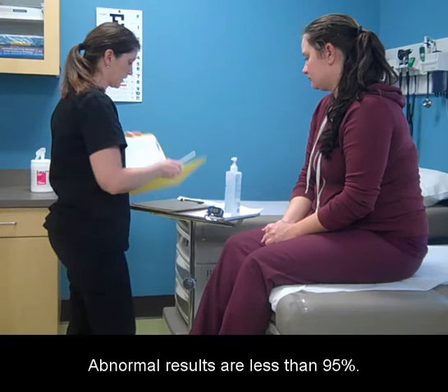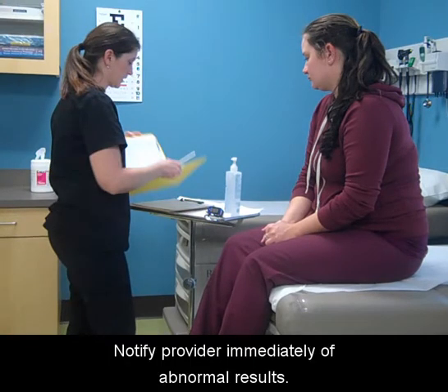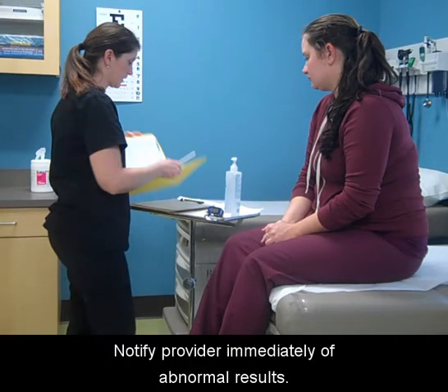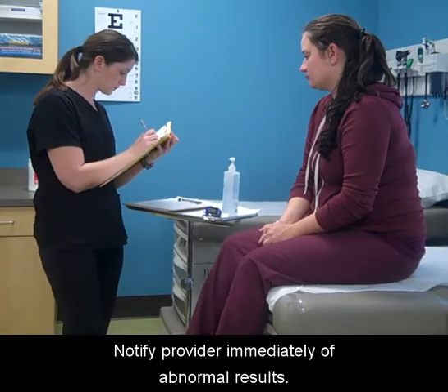Abnormal results are less than 95%. Notify the provider immediately of abnormal results.